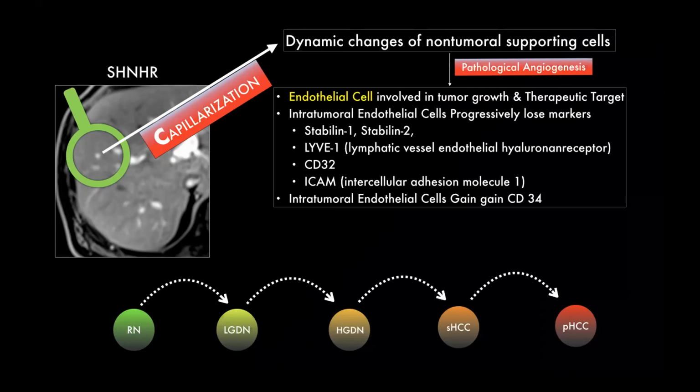And therefore, we use that dictum, better late than never. In all our patients, we have only a late arterial or an arterioportal phase, simply because you want the contrast to get out of the artery and into the capillary, and there you identify the capillarization or the neovascularization. And from there, you start to see the capillovenous network. So a good arterial phase is actually a late arterial phase where you've got good contrast in the arteries, but you also have some amount of venous admixture within the portal venous phase.